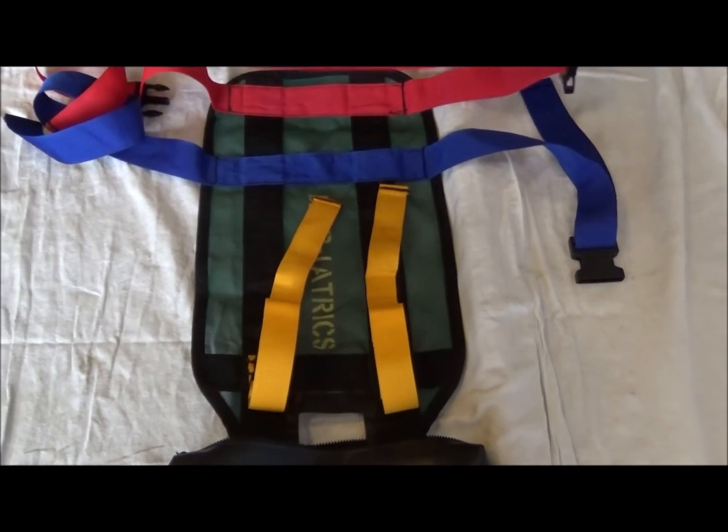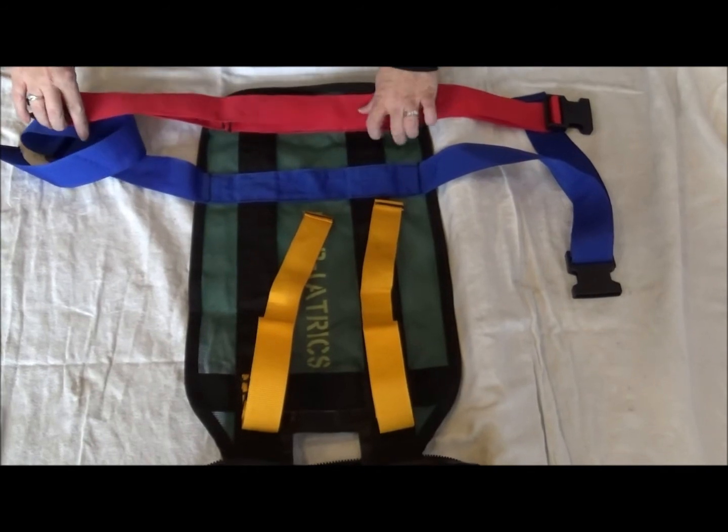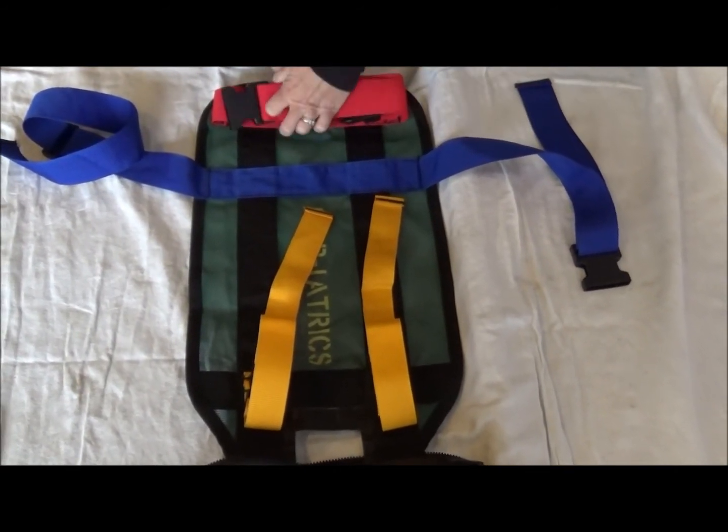The bare stair chair device can be folded up with the device still attached under the stair chair, or you may remove the device from the bottom of the stair chair. This demonstration is the preferred method.